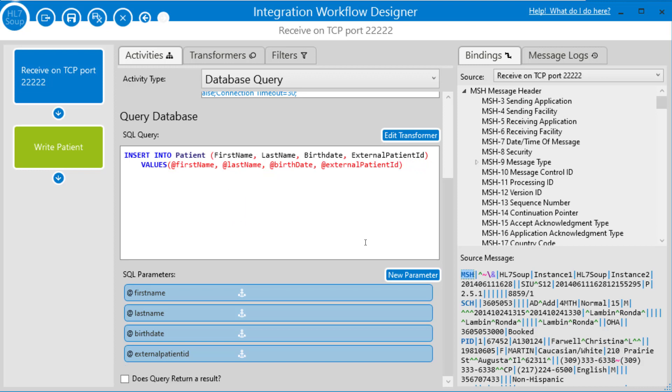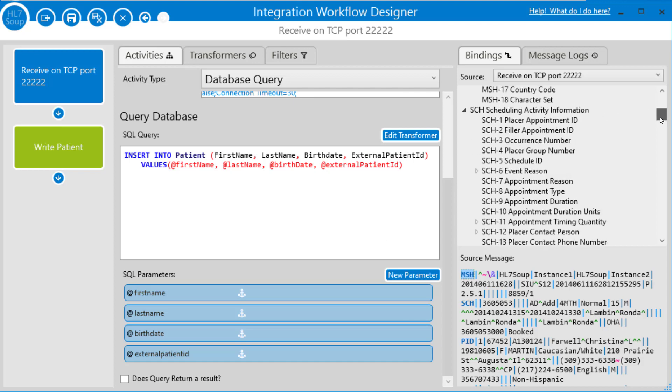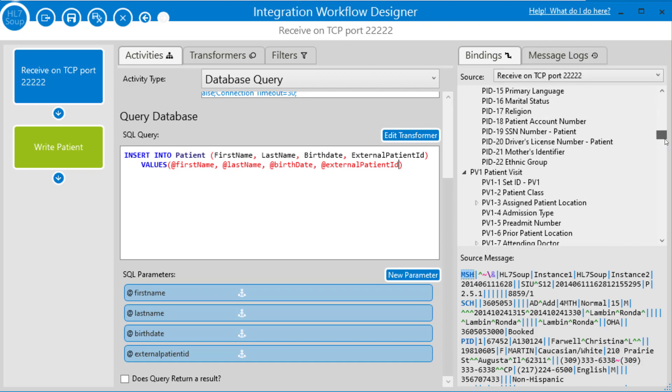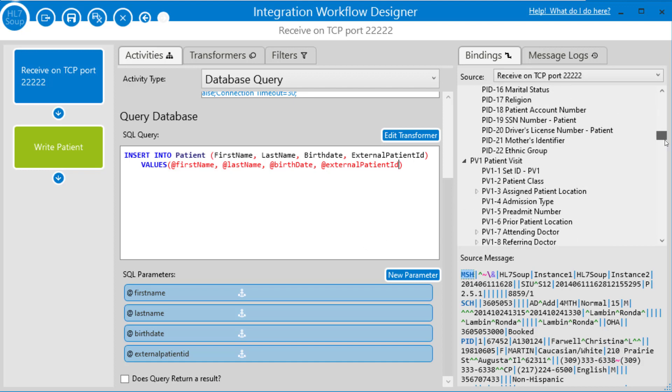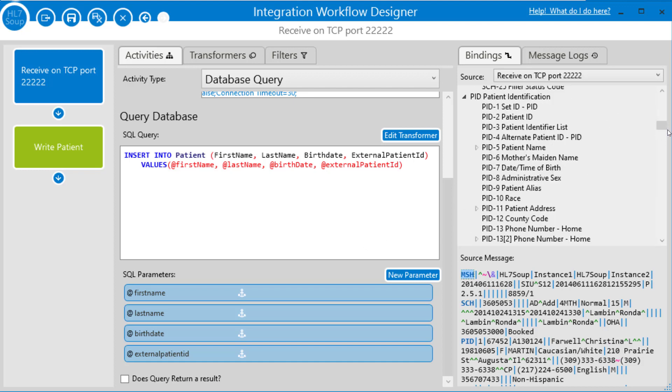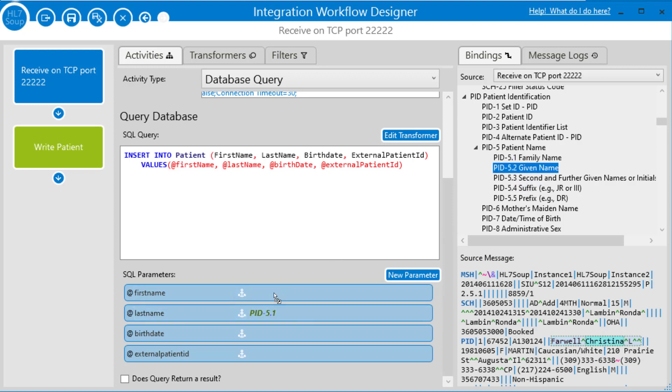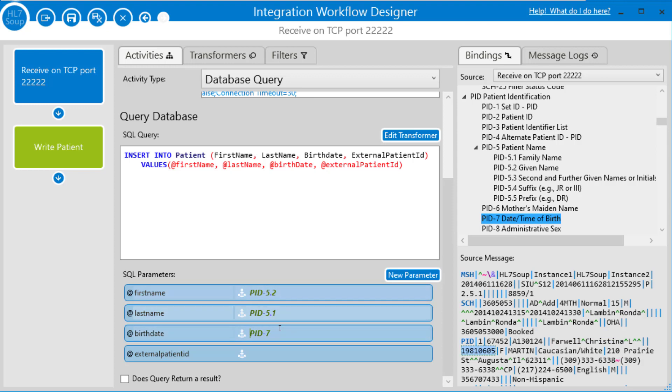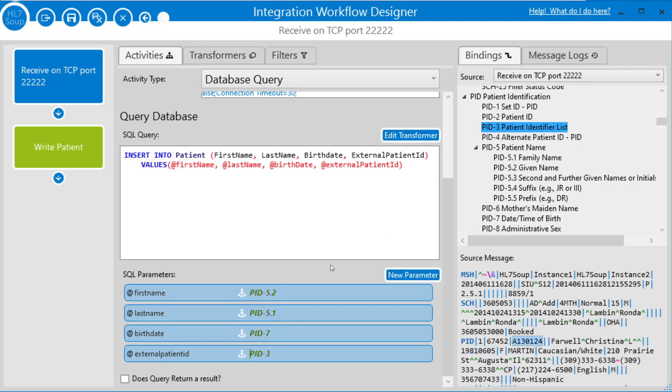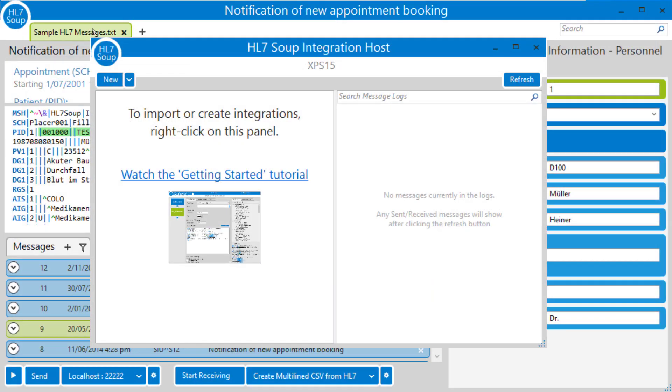And now I just need to populate the values of these parameters. So because we added in the message template earlier, I can just use the binding tree here and find the fields that I'm after. So we wanted the patient's name, expand that, drag the family name to the last name field, drag given name, and the date of birth. And we were using the PID3 for our patient ID. Okay. That's the super basics done. Let's save and close. And I'm going to give this a quick try at this stage.